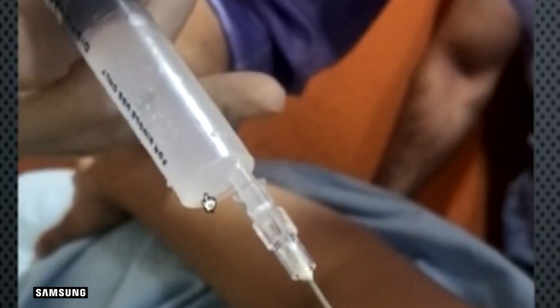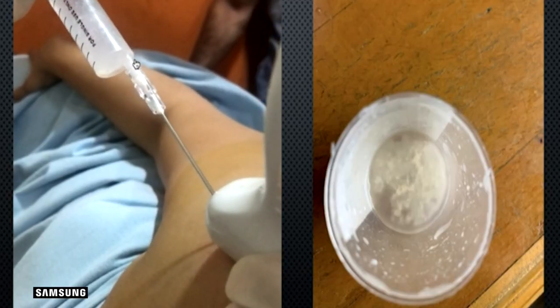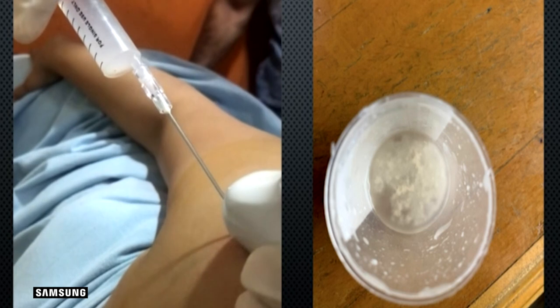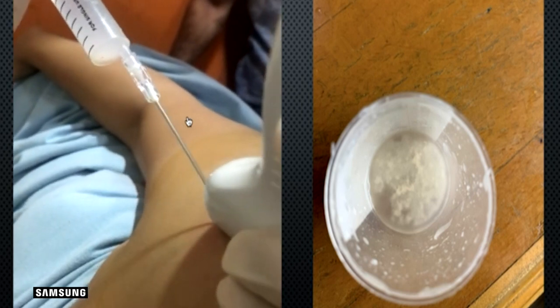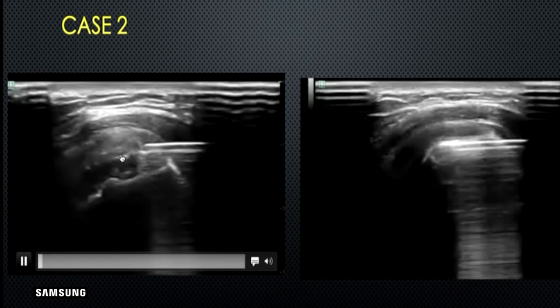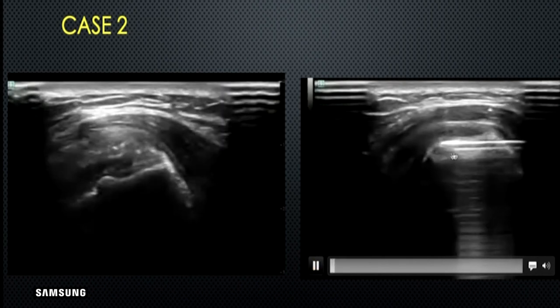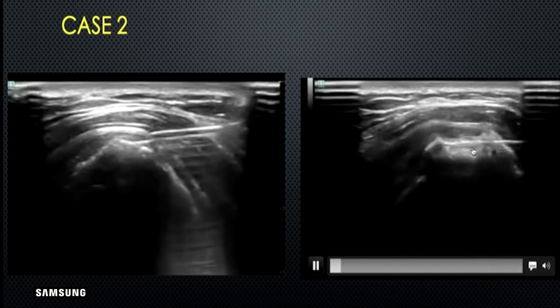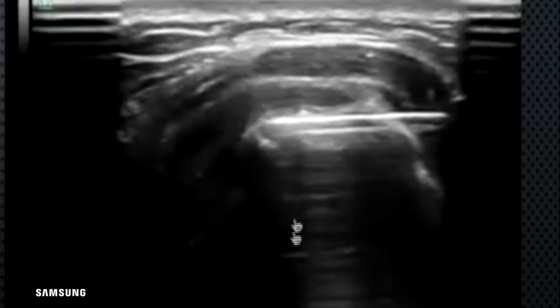As you pulse, the calcification comes into the syringe and can be pushed into a sterile container. Sometimes the needle gets blocked — you can see a puff of smoke with lots of calcium coming out. Using a spinal needle is better because the stilet can remove the blockage when calcium blocks the needle. At the endpoint, the majority of calcium is broken — you see only an empty cavity with an opening-closing picture where earlier there was a hard shell.